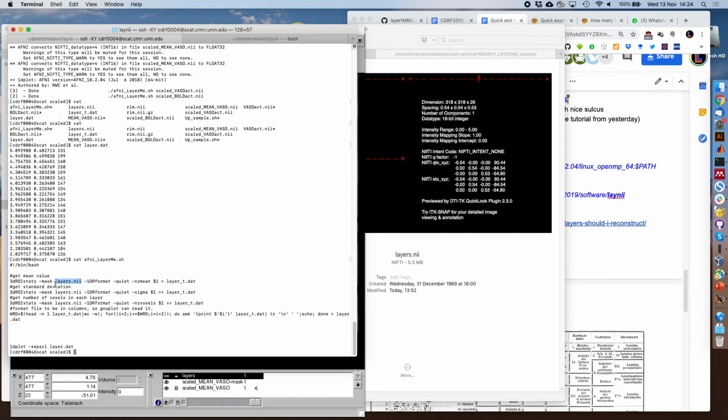Is your upsampling always done in image space, or do you alternatively upsample k-space data? I did both. I don't see a huge difference. Valentin Kemper gets credit here. At the scanner, you can upsample the images in k-space.